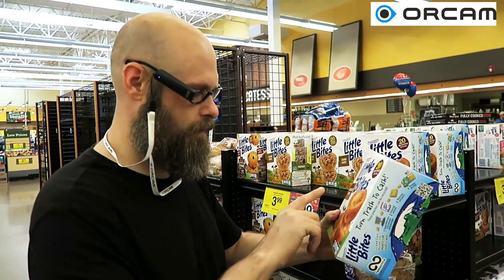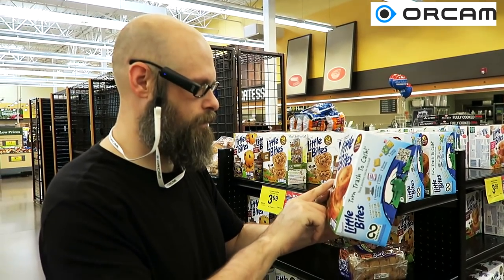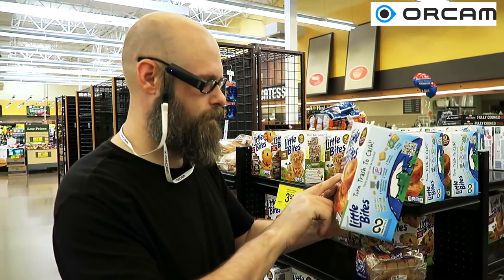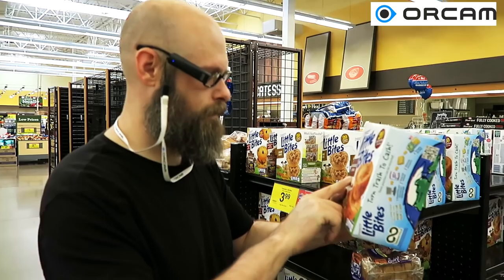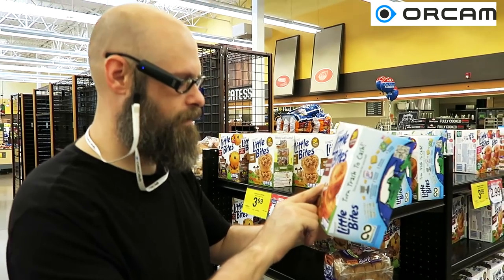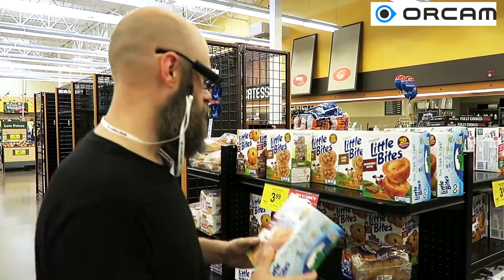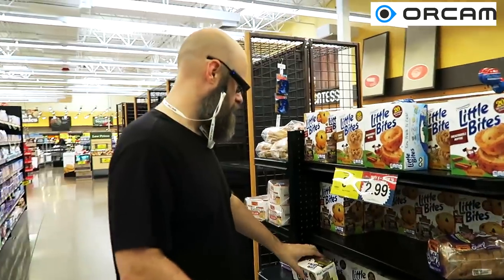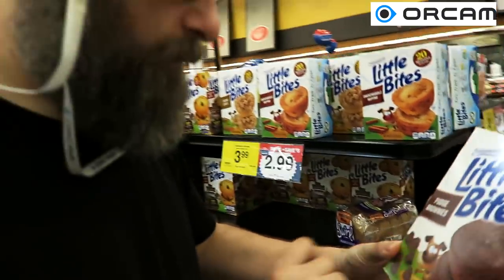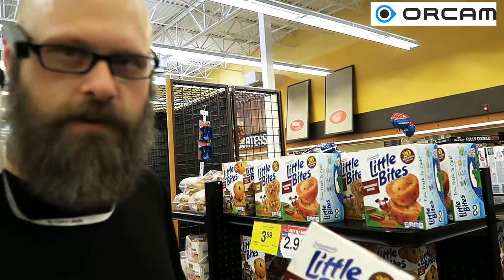All right, let's try out a different one. It told me to lower my finger. Not getting it — let's try a different one. Processing... Fudge brownies. They got it.